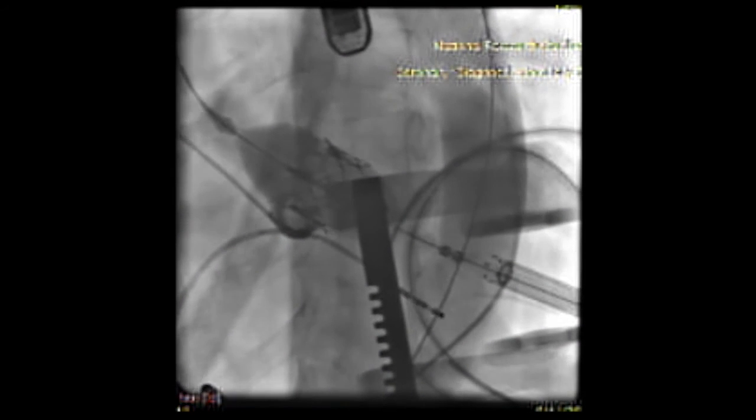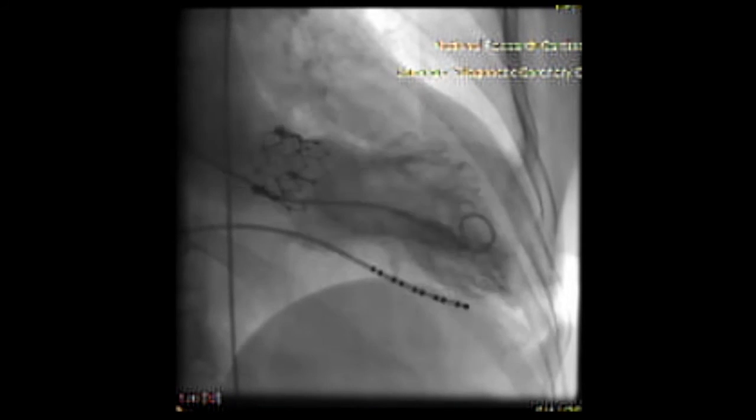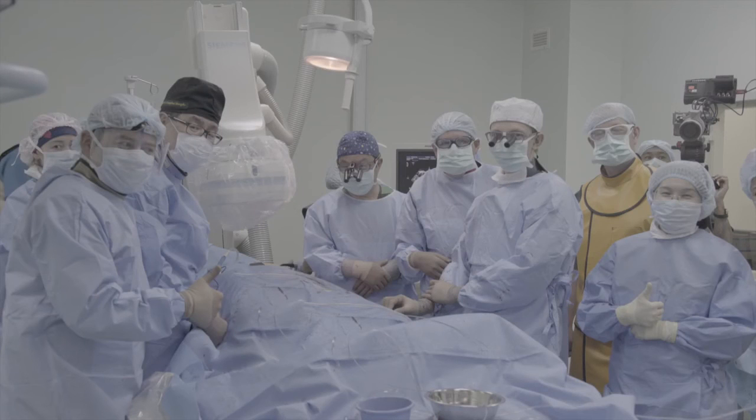Here, you can see the heart valve being deployed through the sheath from the access created by the HeartStitch TA. We verify the success of the valve, and at that point, the procedure is complete, the knots are tied, and we had a successful first and second case using the HeartStitch TA.